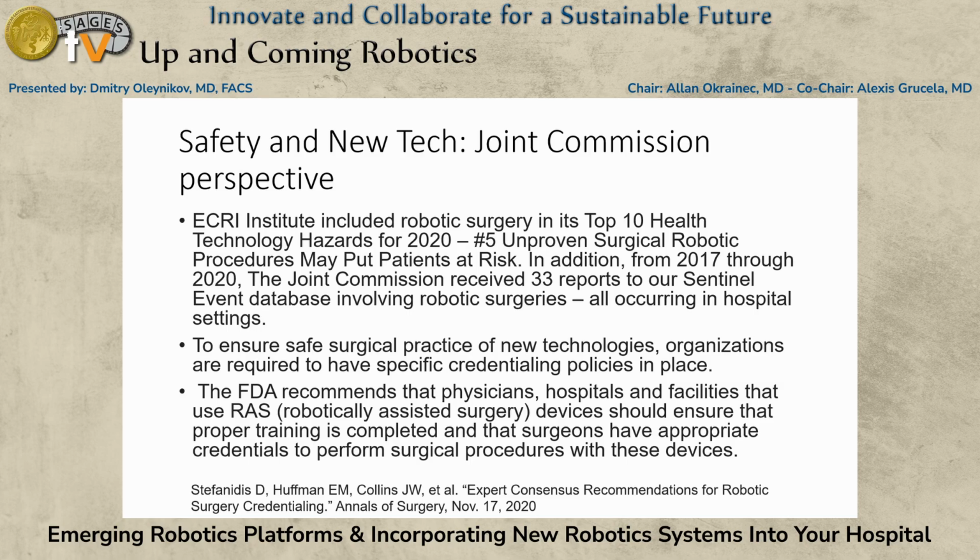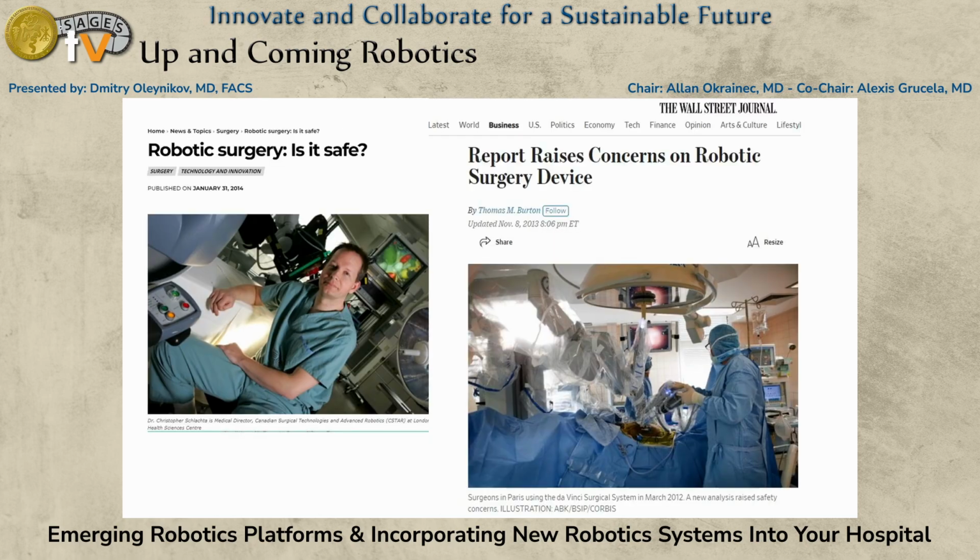In fact, I could share with you that as part of the MIRA approval by the FDA, a number of tests had to be done to show that the training program was valid and helpful and safe for the surgeon to complete. And so that's an important thing that the FDA asks every industry to do.